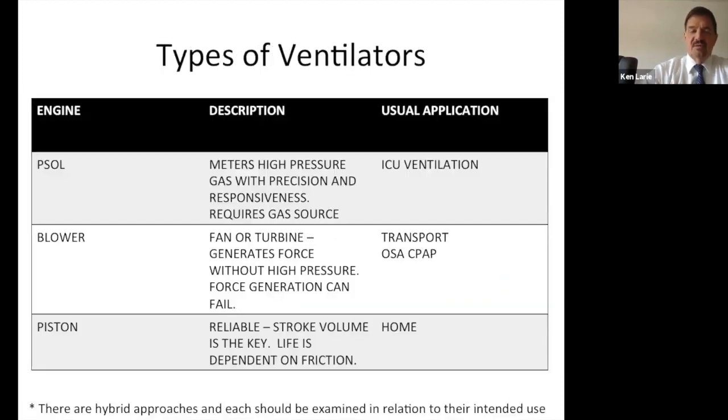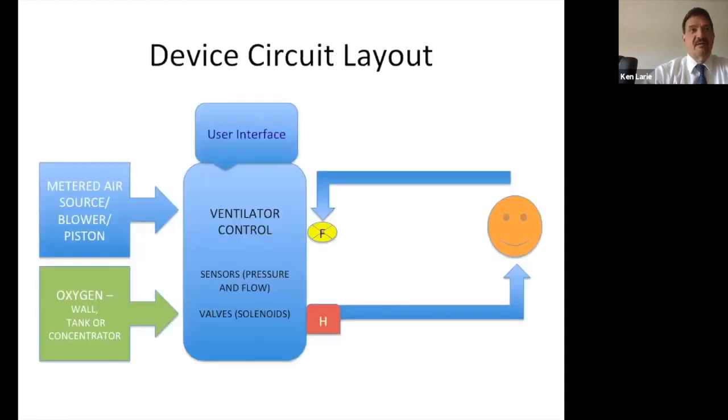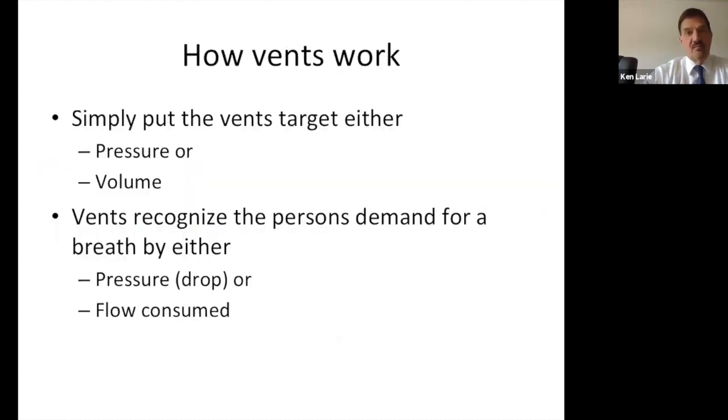Sure. Now, a ventilator is a short-term breathing support system, not to be on for more than a few days, a week. So in general, if we look statistically at mechanical ventilation, most patients are off the ventilator within 24 to 48 hours.